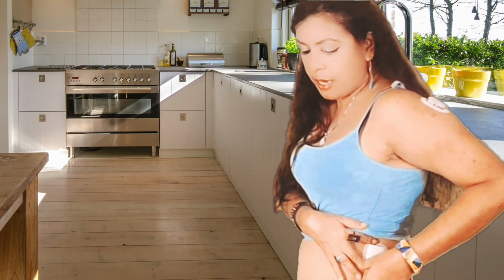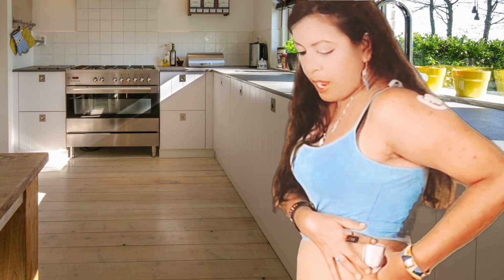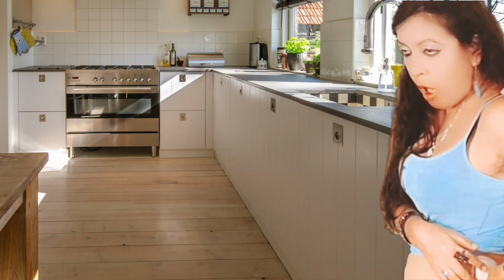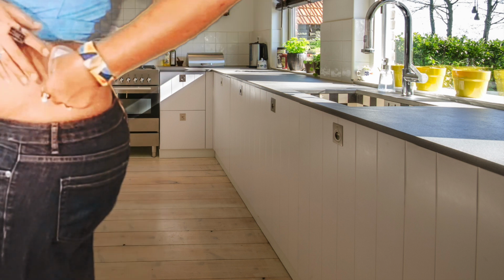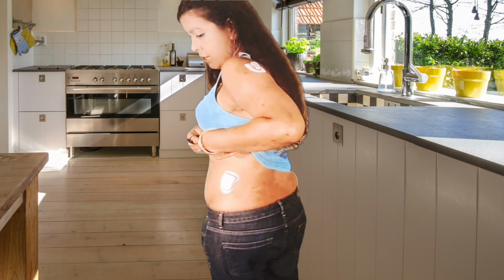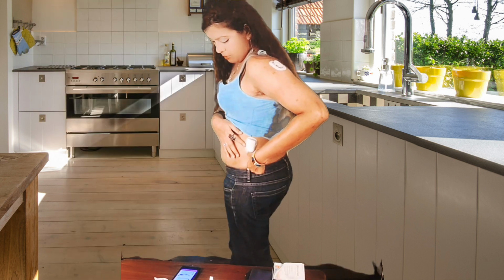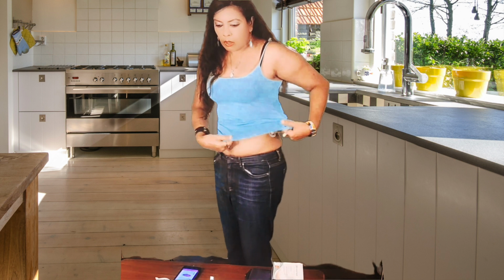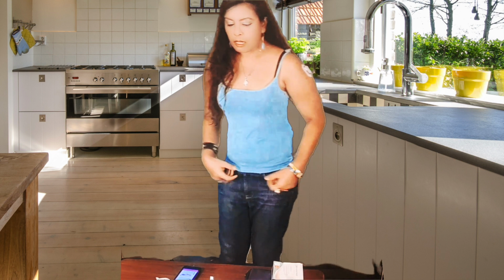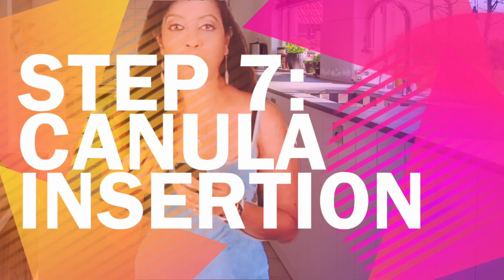Alright, so most cases I get a good 3 days out of the parts that I wear, okay? Nevertheless, parts can come off and things like that, so I try to ensure that it's as flat as possible. Can you see? I think it has been stuck properly. I think it's flat, but it's stuck all right. That's it, so I'm pulling my top down, and now I am actually going to be inserting the cannula, okay?